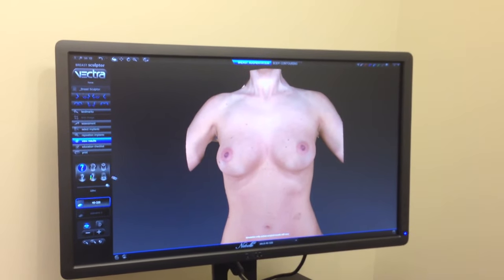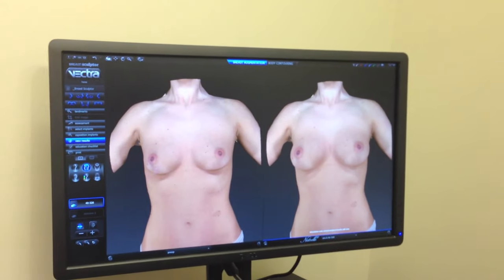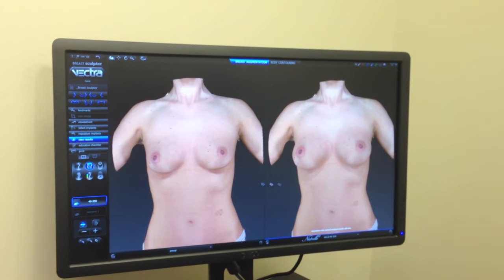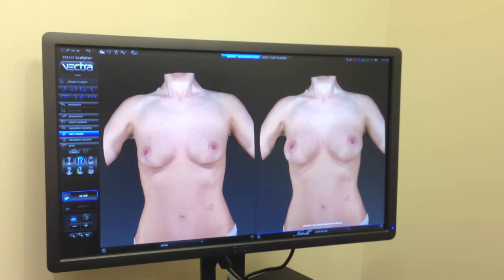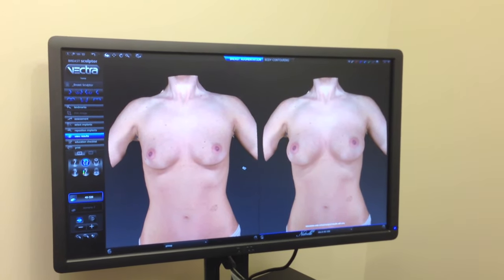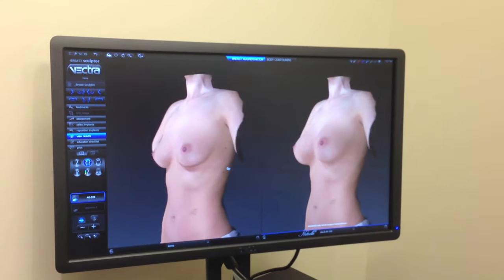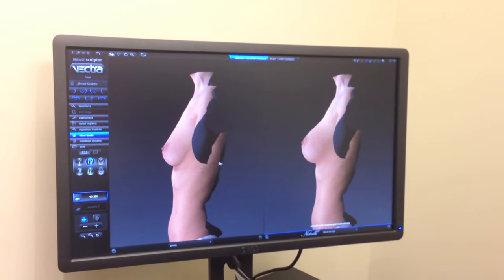And now, what I'm going to do is show her before and after and you can see before this is what she might look like and after with a 320cc implant this is what she might look like. And again we can show her before and after from the front view and then we can show her from the side view.